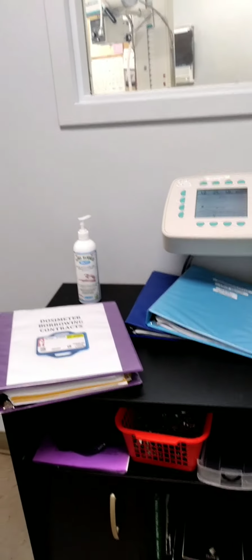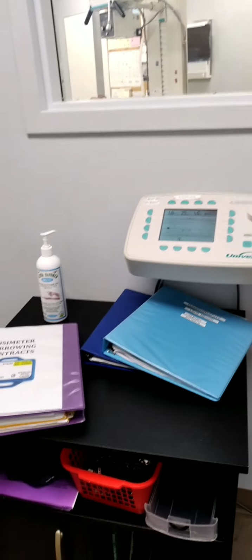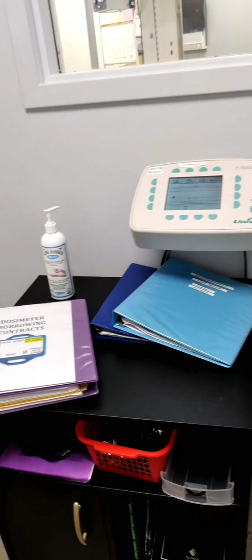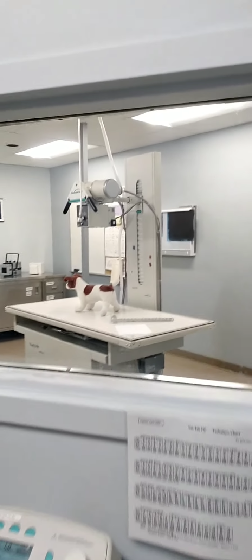This is our little cupboard where we keep some of our logbooks, but the logbooks actually have a different place where they officially live. During the day we will have them out here right close to our console. The console is what changes all the settings. We have a lead glass that looks through into the actual main x-ray room. This glass actually contains lead, so it keeps us safe when we're taking the x-rays. And when you're going into the main x-ray room, this is what that looks like.